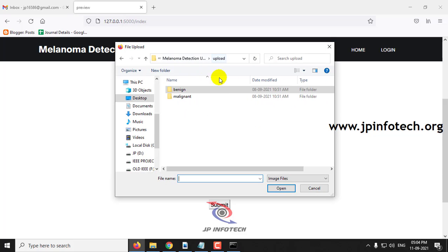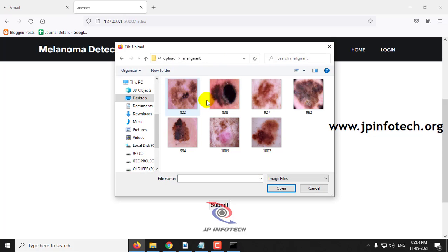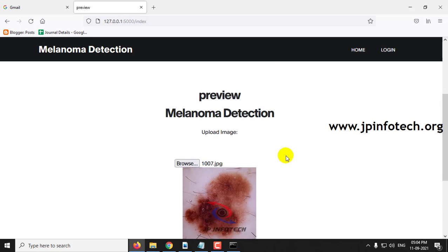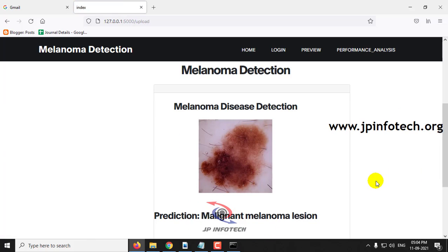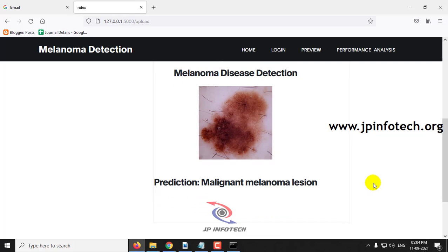Now let me go to the Malignant folder and select another image and click submit. You can see the prediction result for this Malignant melanoma lesion.